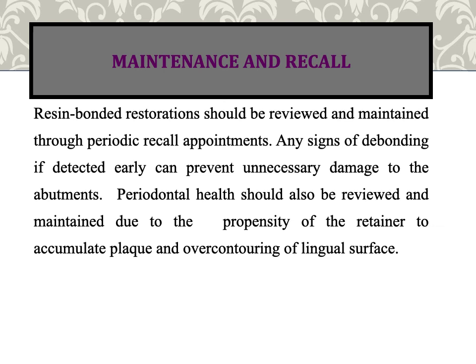Maintenance and recall. Resin bonded bridges or resin bonded restorations should be reviewed and maintained through periodic recall appointments. Any signs of debonding, if detected early, can prevent unnecessary damage to the abutments. Periodontal health should also be reviewed and maintained due to the propensity of the retainer to accumulate plaque and over contouring of the lingual surface.